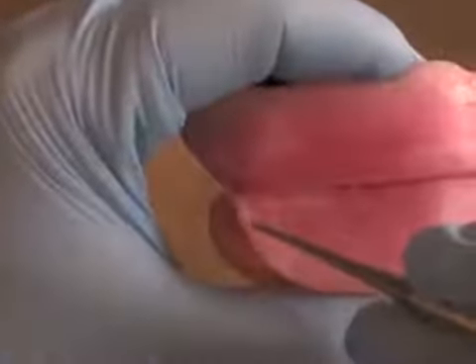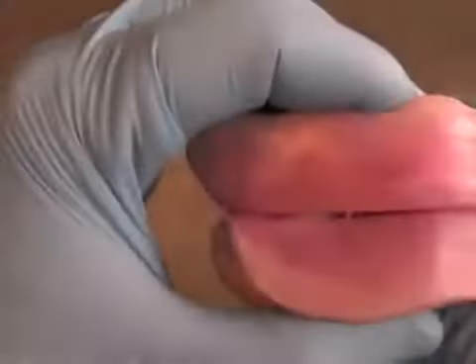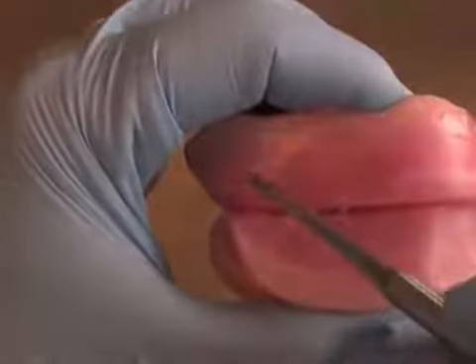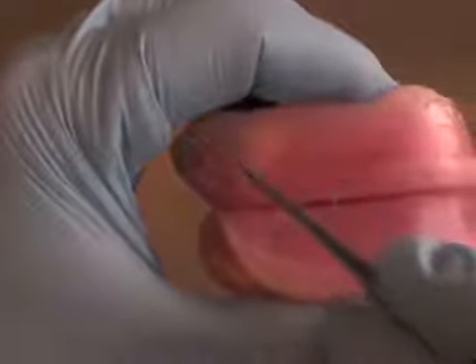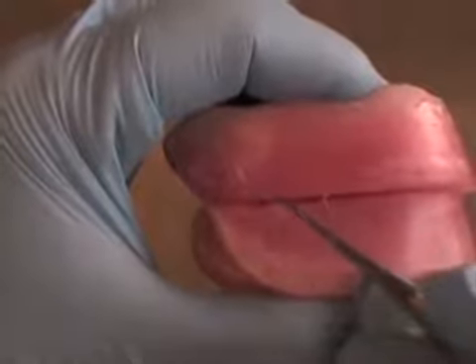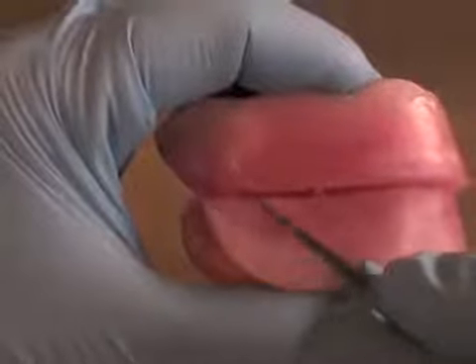Watch for interferences such as you see back here. You can see the record bases actually hitting the rim and keeping the rims from touching together. That's extremely critical. The other thing to watch out for is this type of rim in the maxillary arch where the rim's been taken back too far. This rim should stop about here. That way when the patient comes into protrusion, they won't encounter an interference with this maxillary record base against the rim.